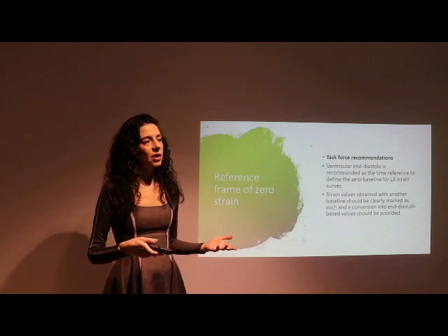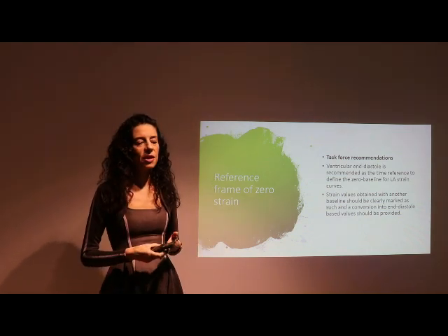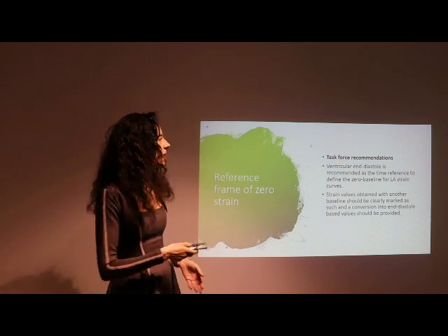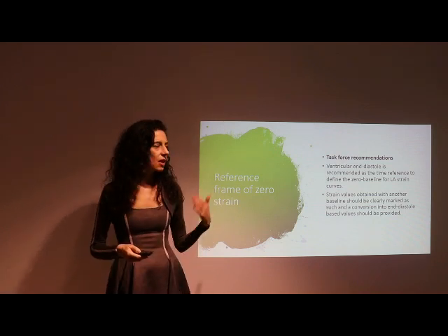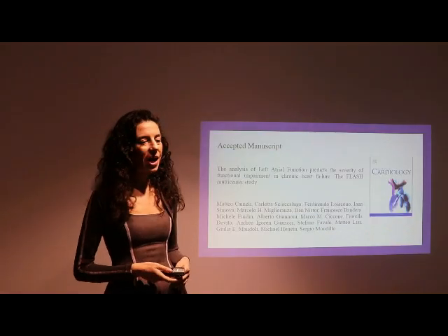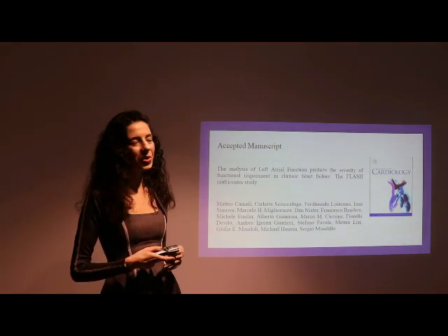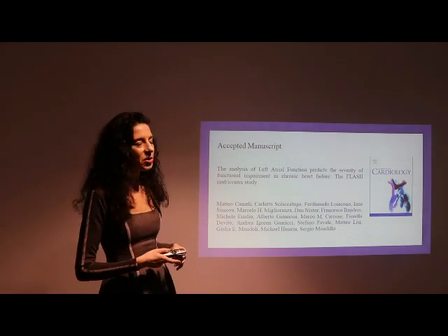All other reference zero lines should be definitely set that have been used, and the values should be recalculated to this kind of reference line. So I would like to share with you now a very recent manuscript that has been accepted but not yet published in the International Journal of Cardiology.